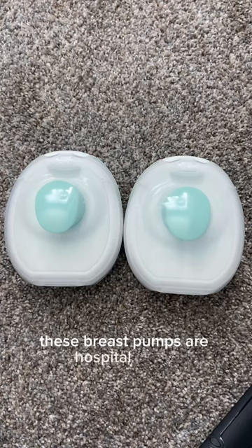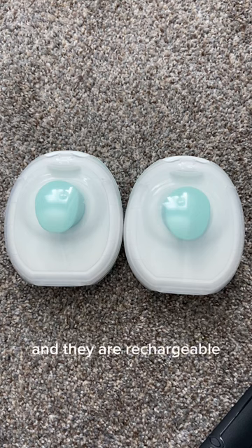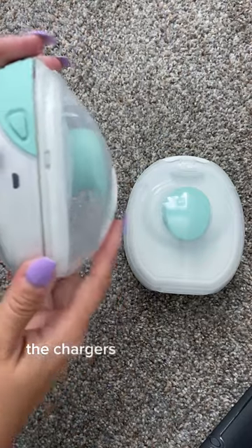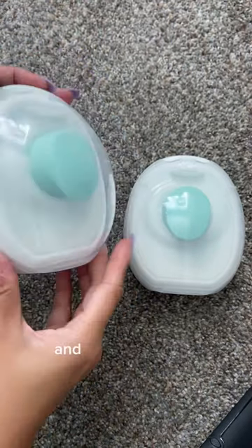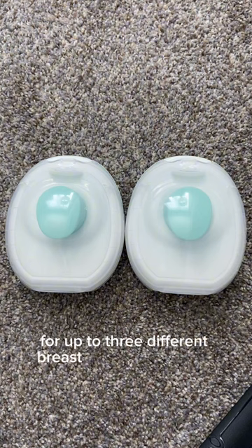These breast pumps are hospital-grade. They have a suction of up to 280 millimeters of mercury, and they are rechargeable. The chargers are a mini-USB, and for each charge, this will last for up to three different breast pumping sessions.